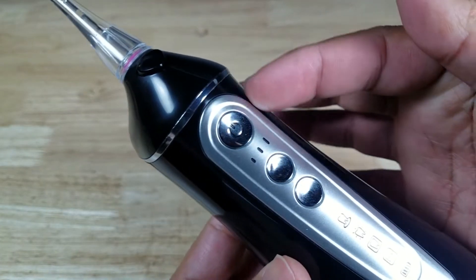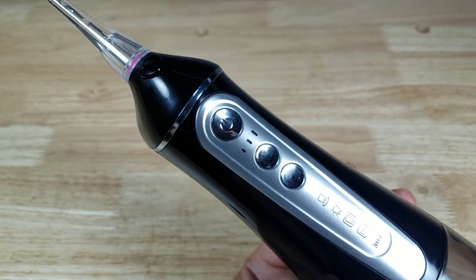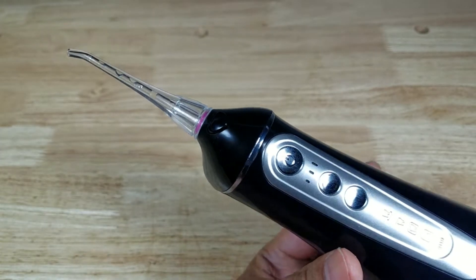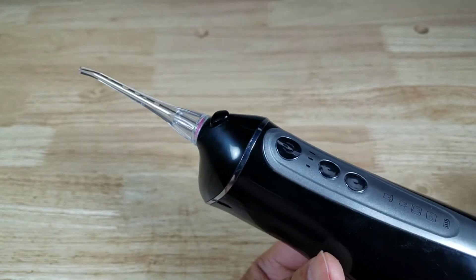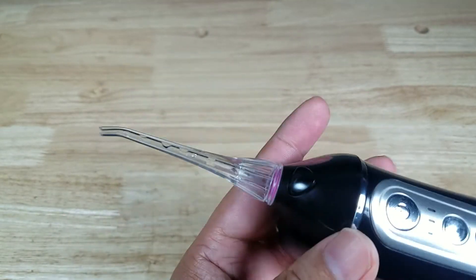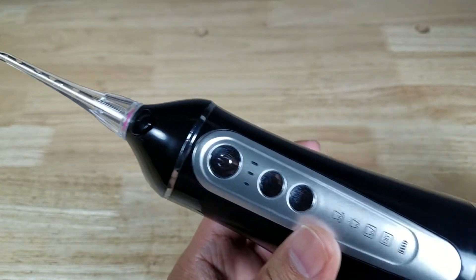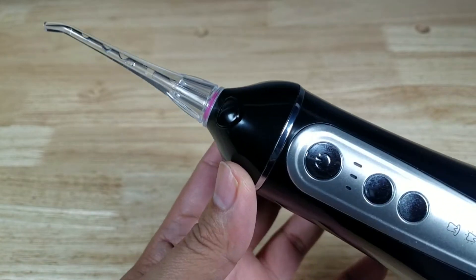Before getting into the functionality of these buttons, a reminder: make sure you're either totally out of water in the reservoir before you take this out of your mouth, or that it's completely off. Because if it turns on — which is probably going to happen to everybody — you're just going to have a massive sprinkler system going off out of that tip. So make sure it's completely off or completely out of water when it's not in your mouth.